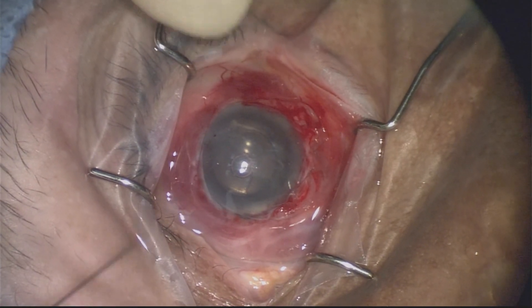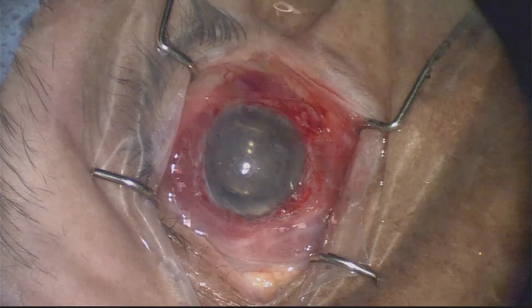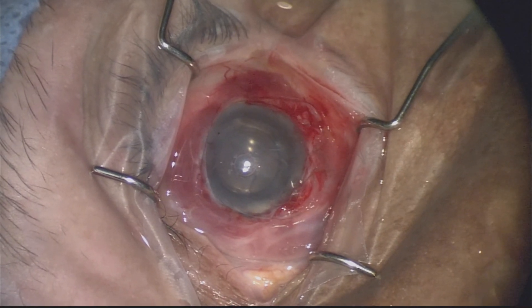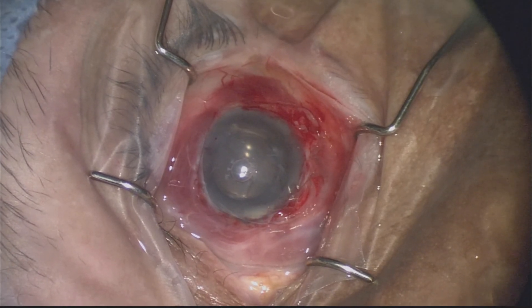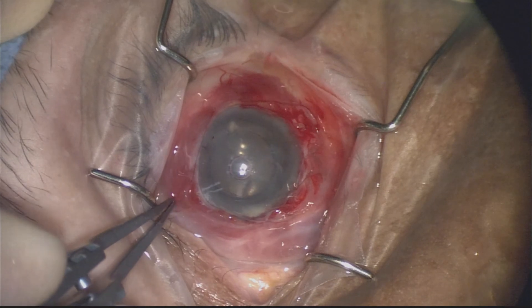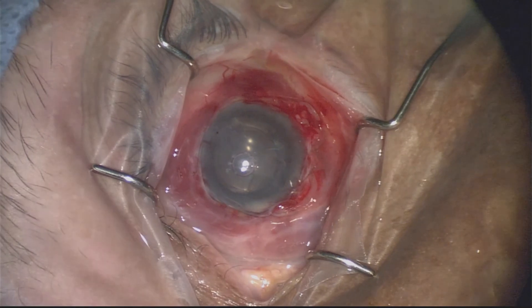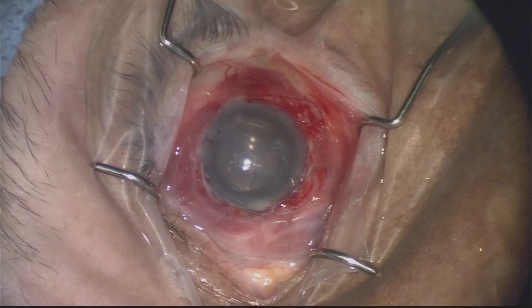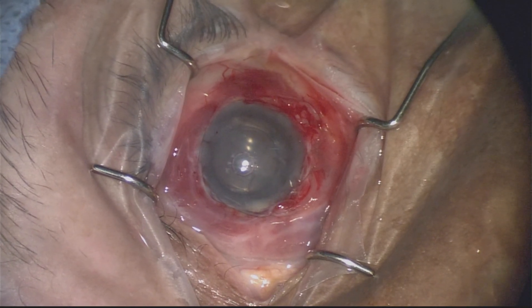Here I'm applying the antibiotic and steroid. You could also put a bandage contact lens on top, which I did after removing the drape — I usually put a large bandage contact lens on once the drape and speculum have been removed, being careful about using a contact lens with the speculum still in place. I hope that's been an interesting video, and I'll try to be more regular with my uploads in the coming weeks.